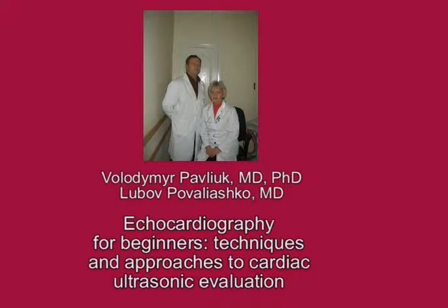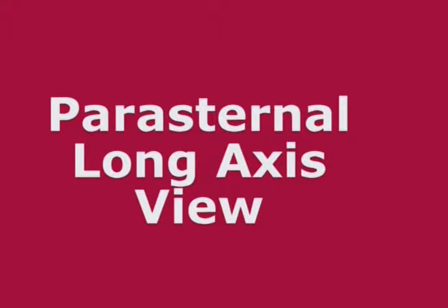Echocardiography for Beginners, Techniques and Approaches to Cardiac Ultrasonic Evaluation. Parasternal long axis view.